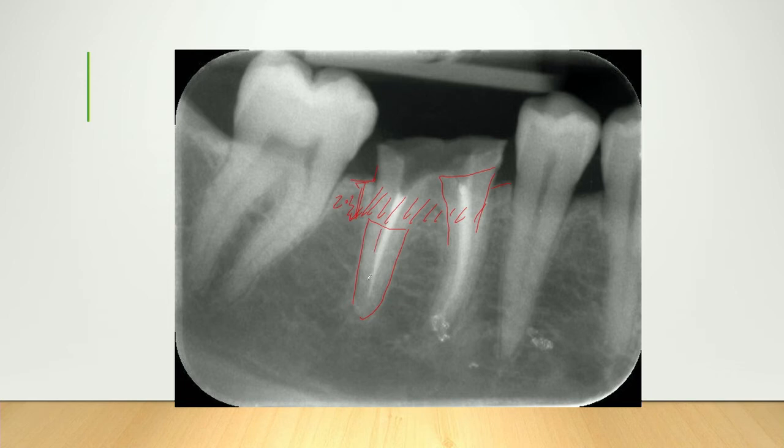When it's tricky is if it's root canal treated. I'd prefer to take that root out if it's root canal treated. But if it's down to the tip like this and I really can't get the rest of that out, I just basically drill the GP out and leave the retained root.